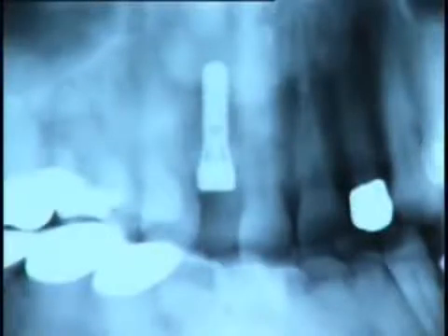The post-operative X-ray shows the correctly placed Straumann Standard Plus implant with the implant axis in good parallel alignment with the adjacent teeth.